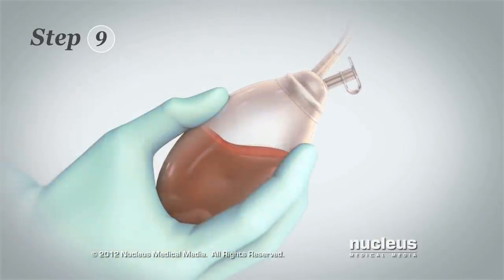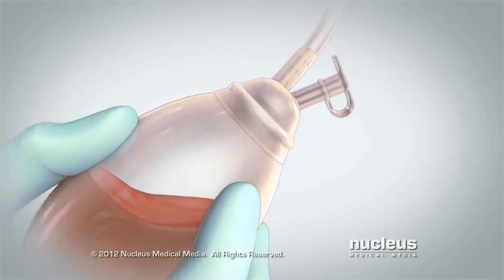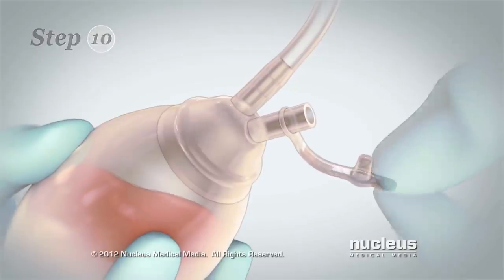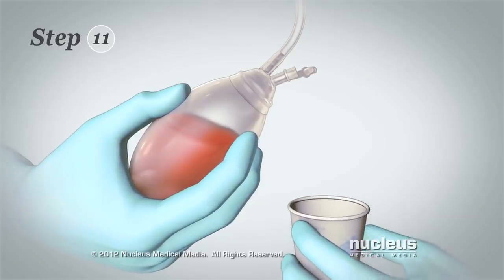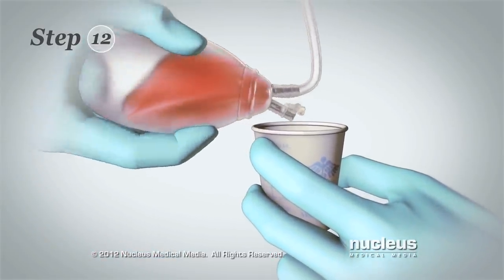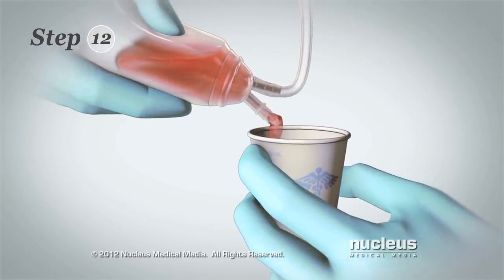Step 9: Point the bulb away from your body. Never squeeze the bulb before taking the cap off. Step 10: Remove the cap — never touch the opening with your bare hands. Step 11: Hold the measuring cup under the bulb. Step 12: Turn the bulb upside down and squeeze the fluid into the cup.